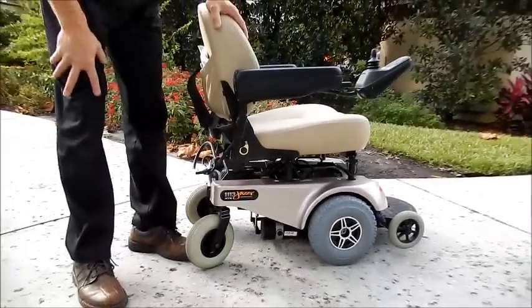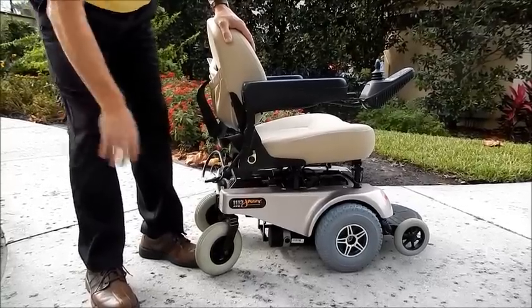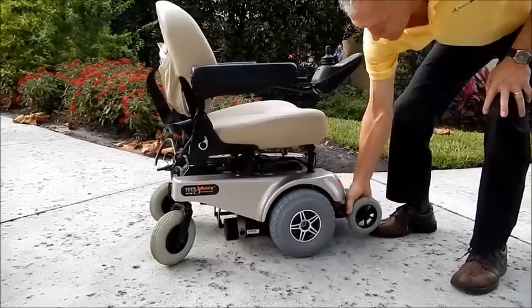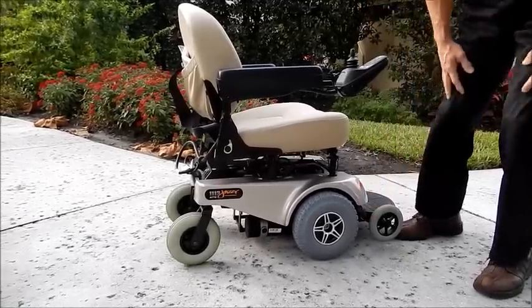This is the Jazzy 1113 ATS active track suspension, which means that the front wheels are tied to the motor. As you can see, the motor going down for a better ride, better suspension.